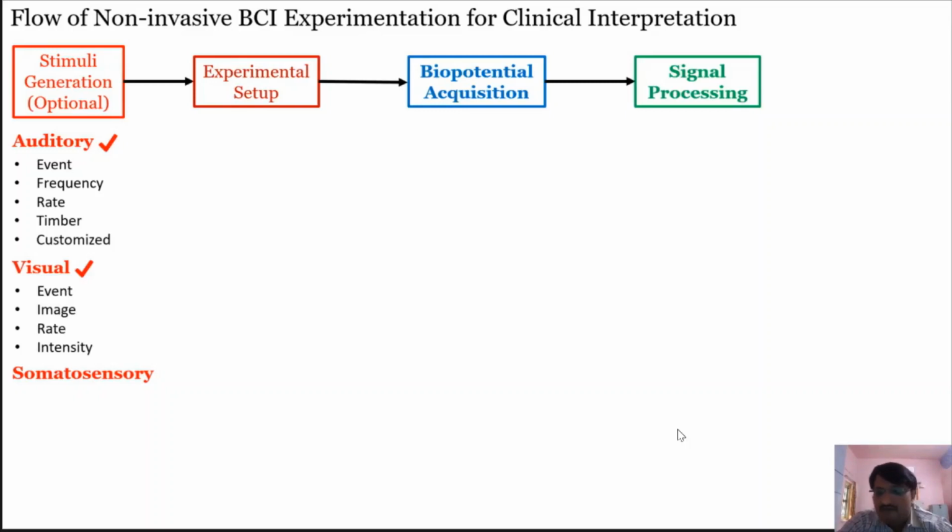One more type of evoked potential is somatosensory evoked potential. Auditory and visual potentials are localized at your ear and your eye, obviously, but somatosensory is global. It is related to your sensations. If somebody touches you, you will clearly get a sensation. So it is like a global evoked potential. Further, we will have a look at the experimental setup.